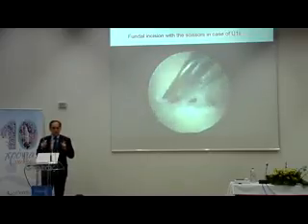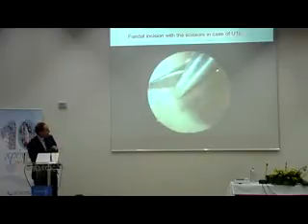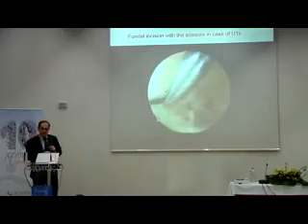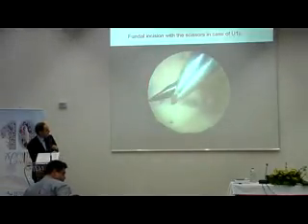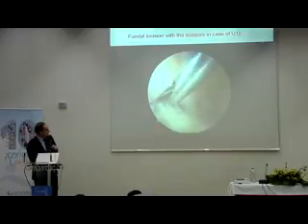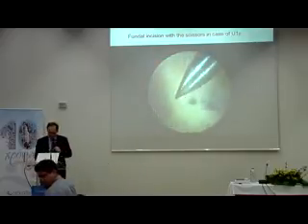Until today we do not know the cause of this small malformation in relation to miscarriage. We cannot explain it clearly. There are a lot of theories, but one of them is that the absence of vessels would disturb the implantation and the growth of the conceptus. But we do not know if it's correct. There we see the vessels are coming.